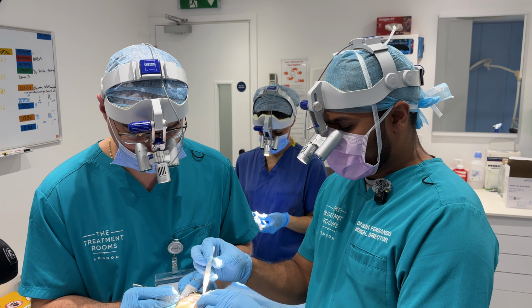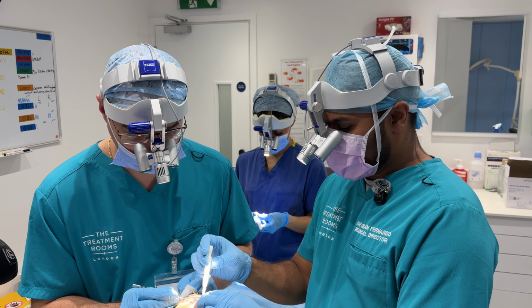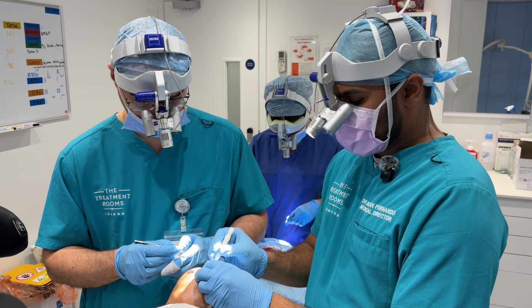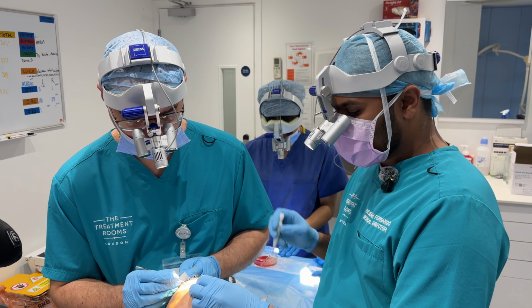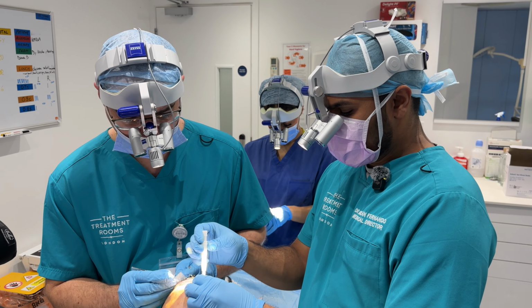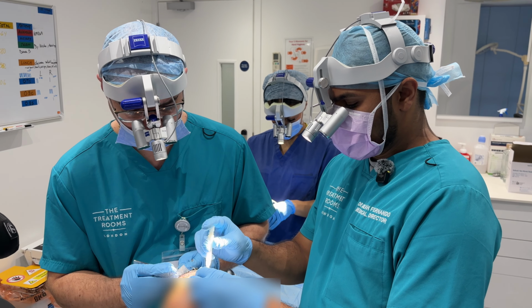How has your experience in the clinic been, David? I've been to a lot of clinics over the years. Of course. But I was just saying to Dr. Vara that I haven't seen the implanter pens in a lot of the clinics I've worked with. It's always been forceps. So it's interesting seeing the two alongside one another. I can definitely see the benefits of using the pens from witnessing it. But obviously there is the nice ability to have somebody in the team who's great at placing with forceps, because there are benefits for the hairline grafts, I think.